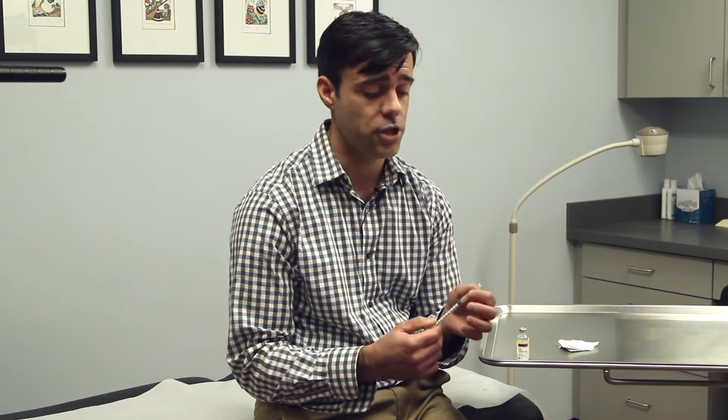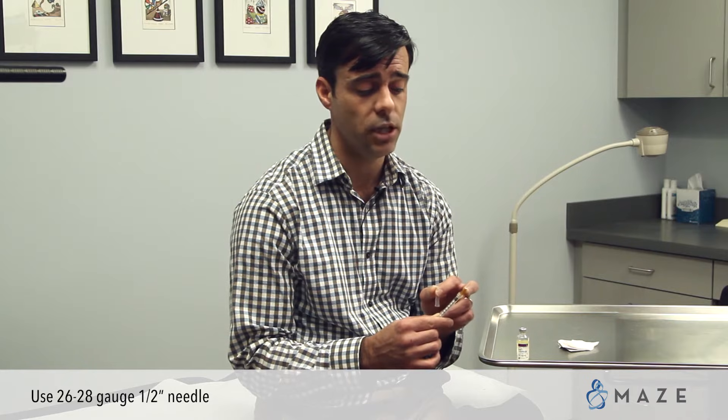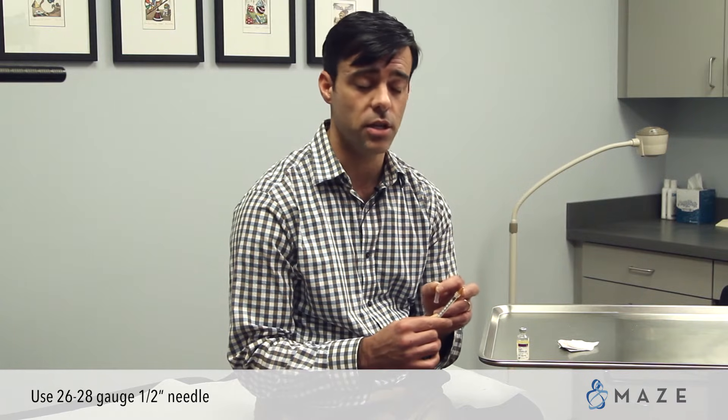In this video we are going to review how to do a subcutaneous testosterone injection. Testosterone can be injected subcutaneously, which means into the fat layer. To do a subcutaneous injection, you want to make sure that the needle on your syringe is a smaller gauge — we typically use 26, 27, or 28 gauge half-inch size needles.